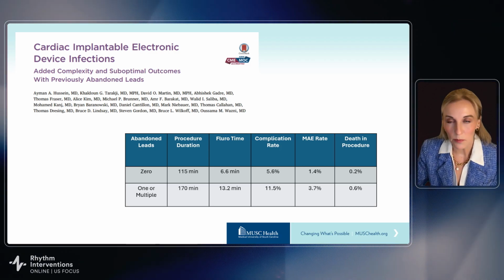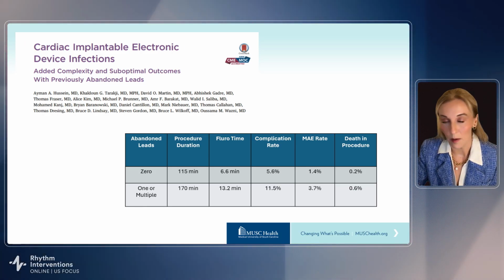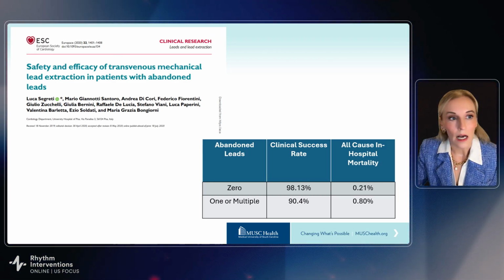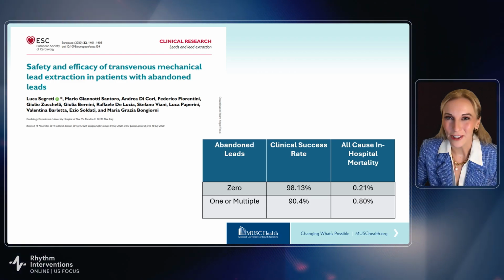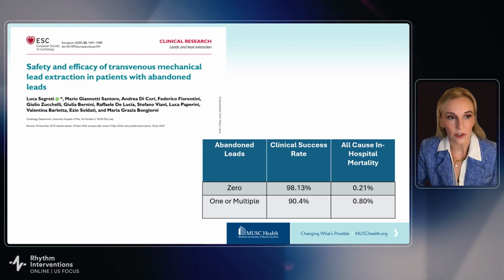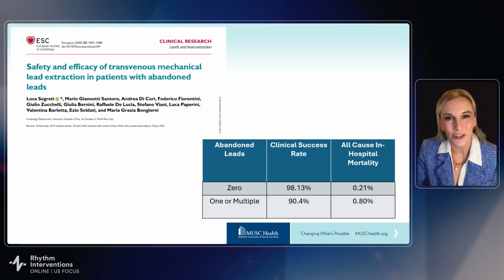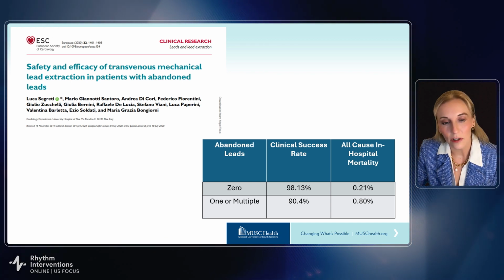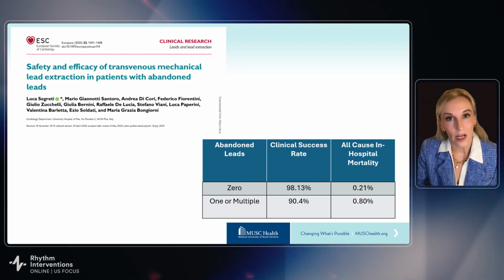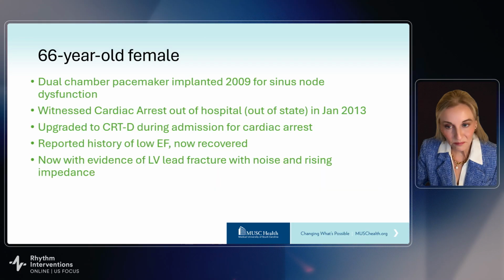Again, suboptimal outcomes and a longer, more difficult procedure time and a higher complication rate as well. And again, just yet another study showing that the safety and efficacy of even mechanical extraction is more difficult in patients with multiple abandoned leads. So we've seen a wealth of literature and data supporting that abandoned leads do have an actual clinical consequence that I think is not readily discussed enough with patients overall.